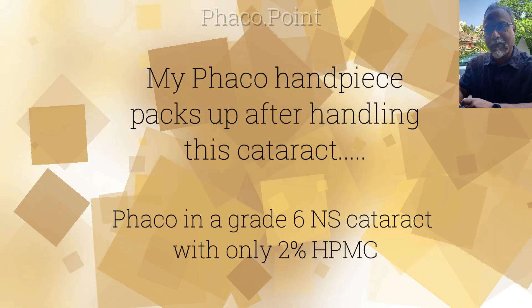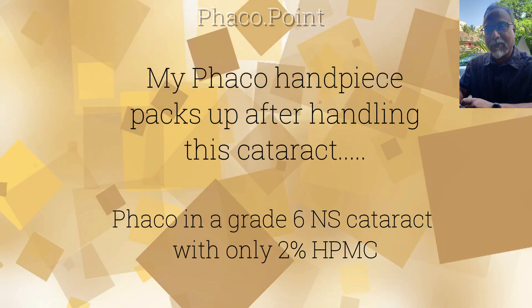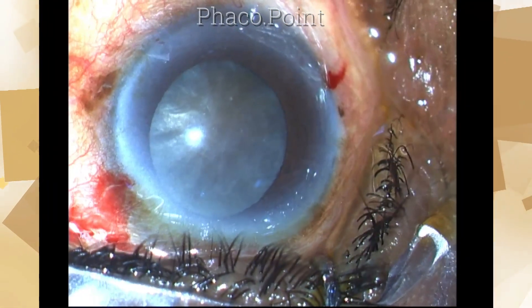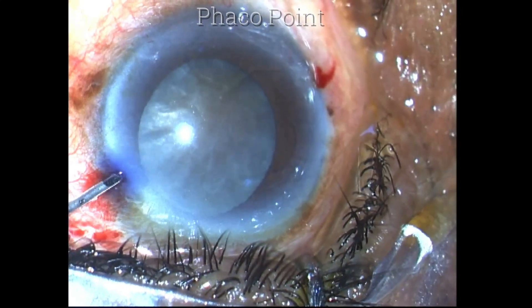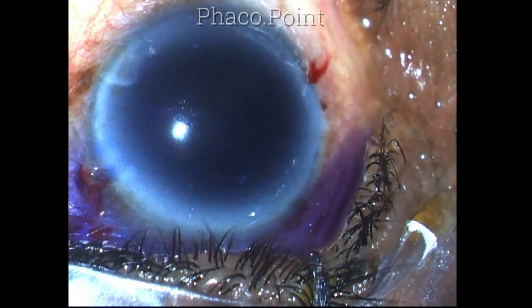My dear friends, I will never forget this case because after performing the phaco emulsification, my handpiece simply packed up. This was a very hard cataract, at least a grade 6 nucleosclerotic cataract, and I'm trying to manage this by phaco emulsification.